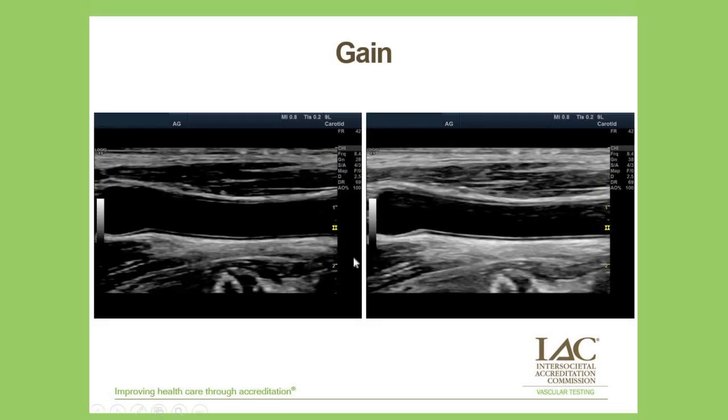So just a couple of images. It might not be a big contrast, but one's a little darker. So this one's darker than the other. And we want to just take time to look at our imaging and just make the best image we can. We have really good machines today, new equipment, and your images come out pretty well. But this is just to go over little things that we can do just to optimize a little better.